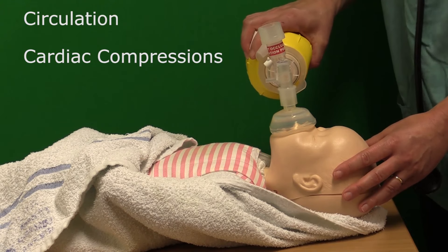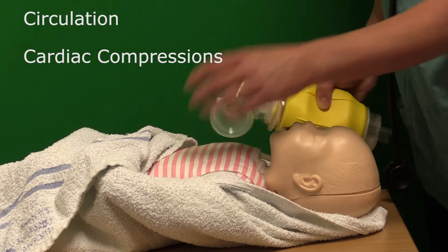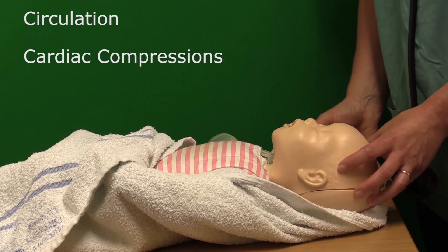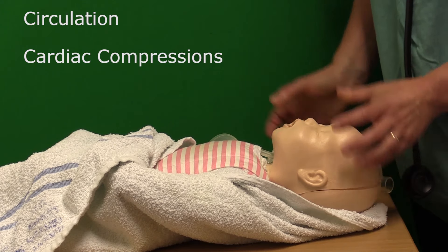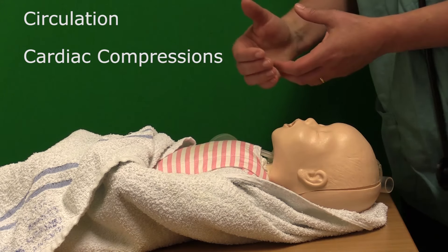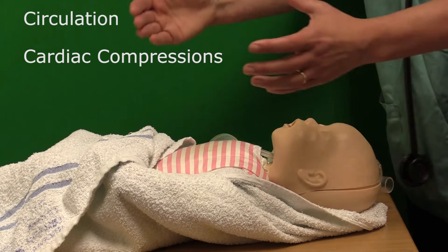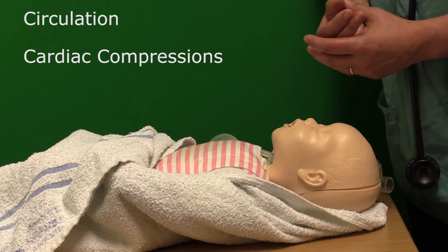So just to recap: the ratio at this point is one ventilation breath to three chest compressions. That is done for a further 30 seconds and then the baby is reassessed again — colour, tone, breathing, heart rate. If you're unable to use the encircling technique because the baby is quite large, your hands are too small, or there are other people around the baby giving other aspects of care, then the two-finger approach can be used.